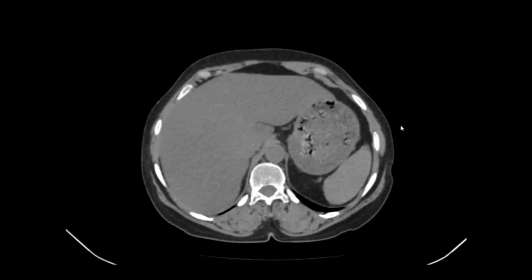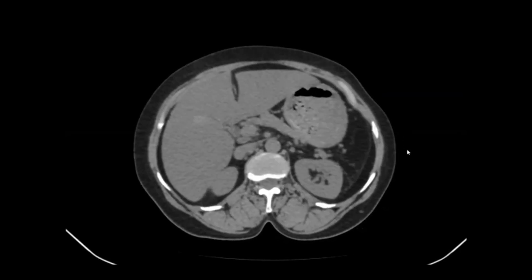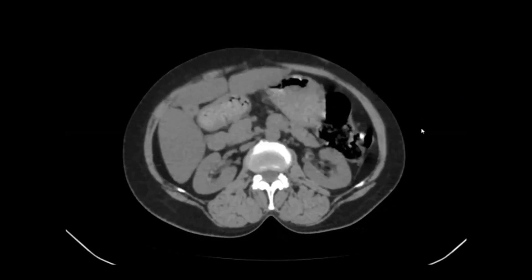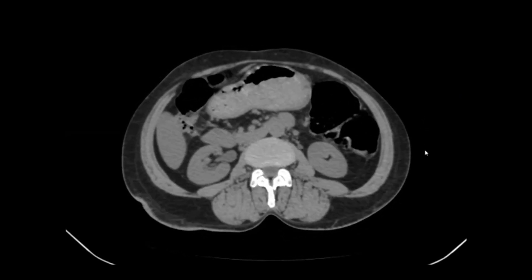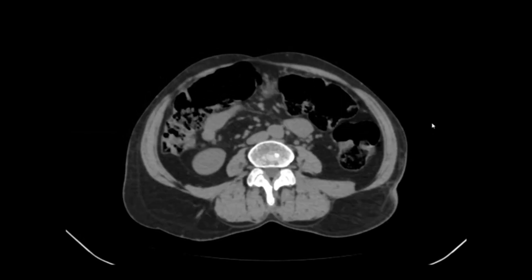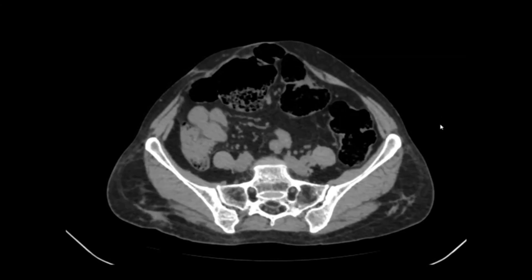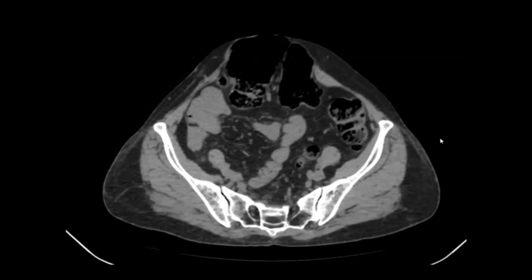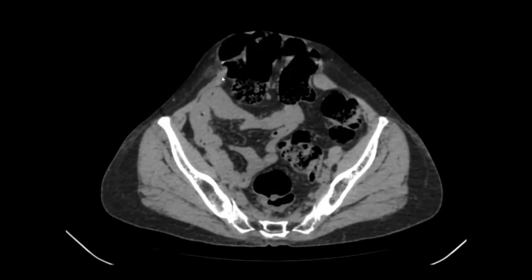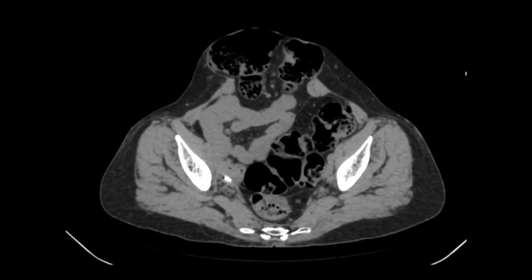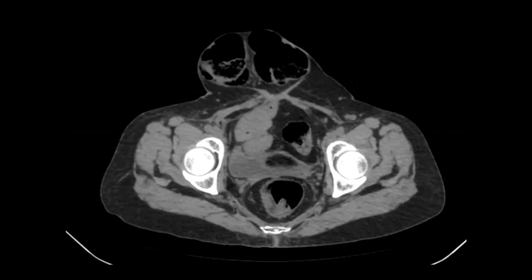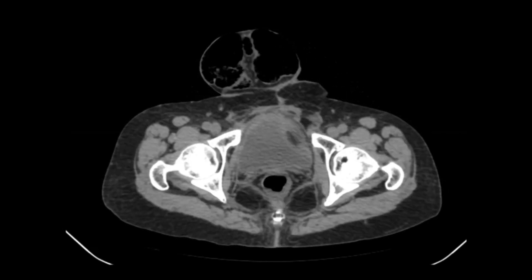So we see a hernia case in which anterior abdominal wall hernia is present. Two important sections are required on CT for calculation of loss of domain. One is the axial cuts. Here as we go lower down in the abdomen we can see the bowel herniating through the defect in the anterior abdominal wall into the hernia sac. Along with the bowel we can see the omentum and its vessels.